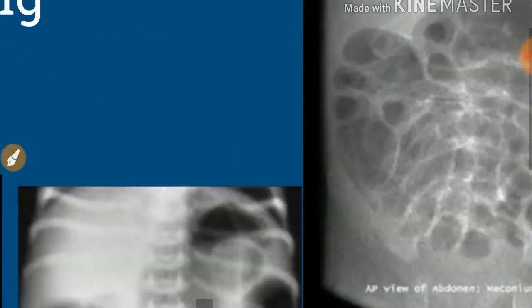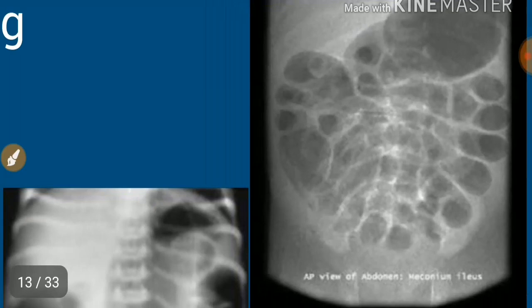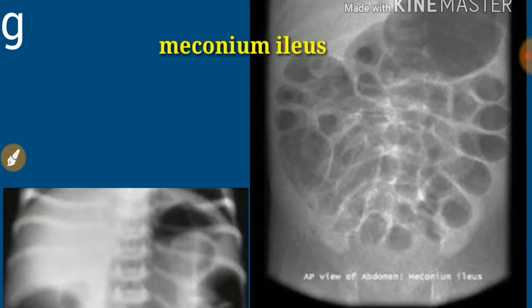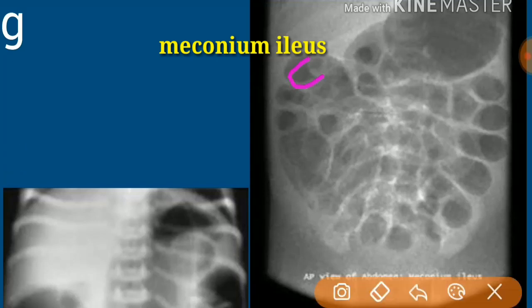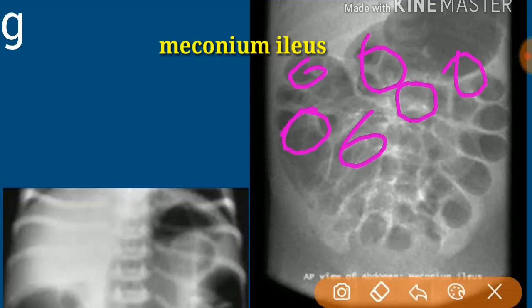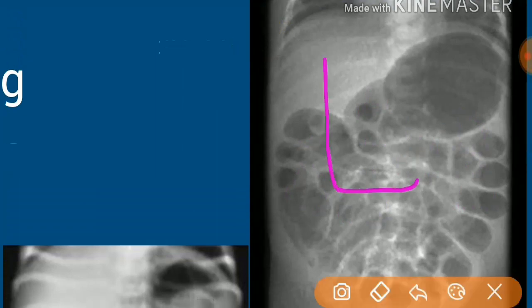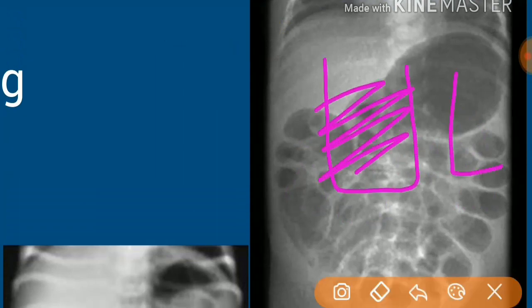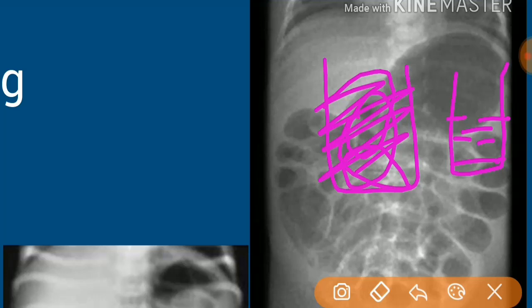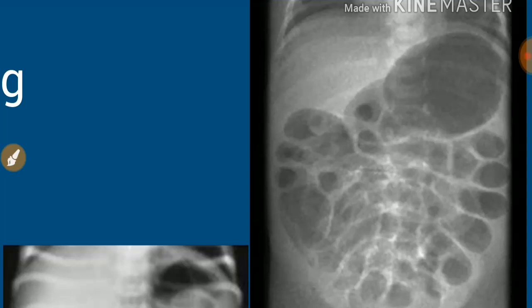Another diagnosis is meconium ileus, where thick meconium blocks the bowel. In meconium ileus, almost all bowel loops are dilated, but there will be no air-fluid levels, because the meconium is slimy and stays mixed with air rather than settling like water. Since it is slimy and sticky, there cannot be clear air-fluid levels. This is how, using air-fluid levels, we differentiate between meconium peritonitis, meconium ileus, and ileal atresia.